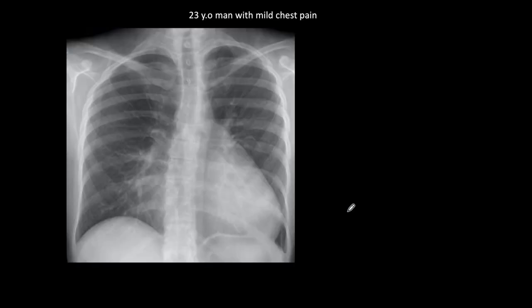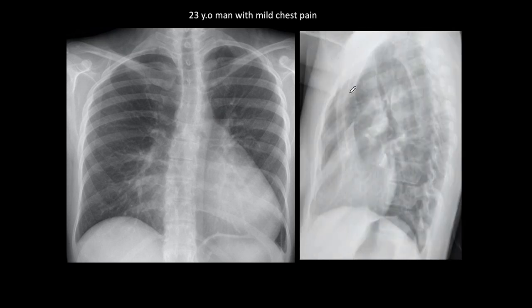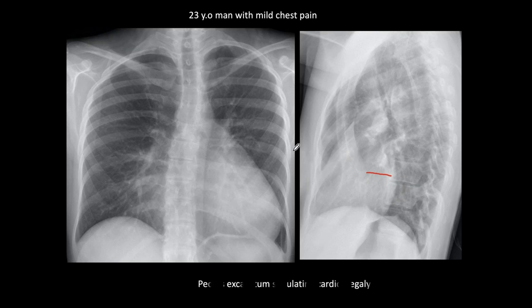Another patient is a 23-year-old man with mild chest pain. The patient has slight scoliosis and an apparent increase in cardiac silhouette size. With mild chest pain, a possible suspicion may be pericarditis in a young person. But on the lateral view what we see is a marked pectus excavatum, narrowing the AP diameter considerably between the spine and the sternum, and of course the heart is displaced to the left because it has no room.